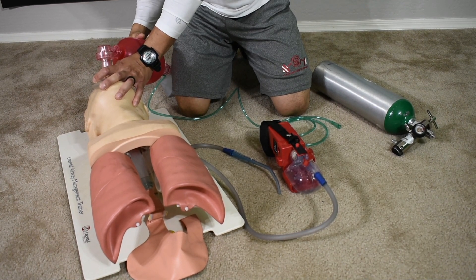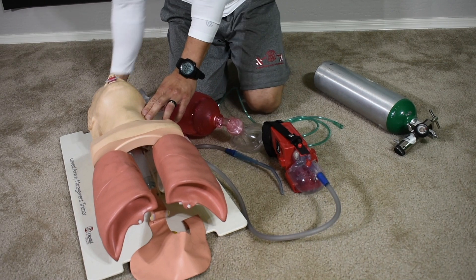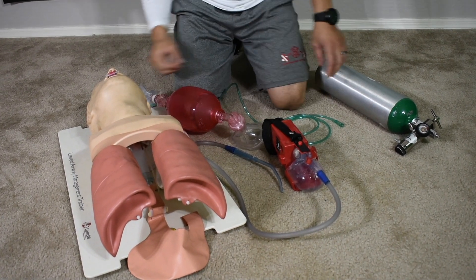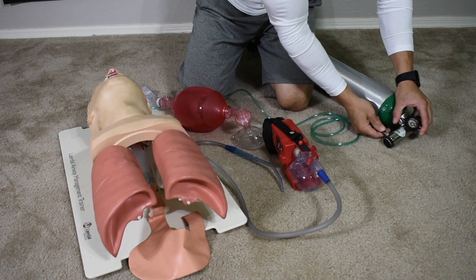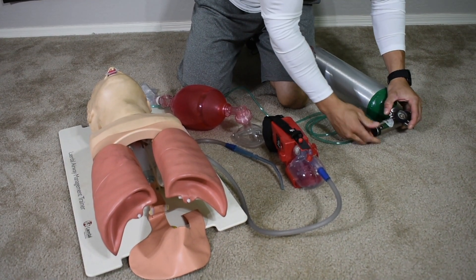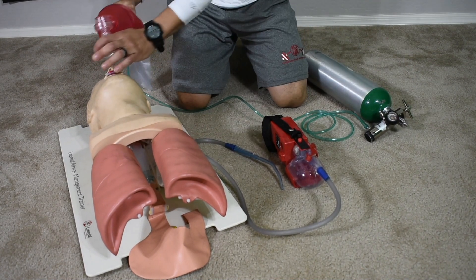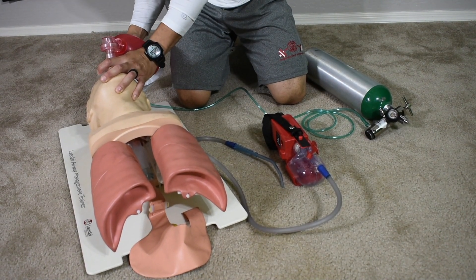Patient is properly being ventilated. I'm going to reassess for a carotid pulse. Pulse is present. I'm going to hook them up to 15 liters of oxygen and continue to ventilate — one breath every five to six seconds at a rate of 10 to 12.